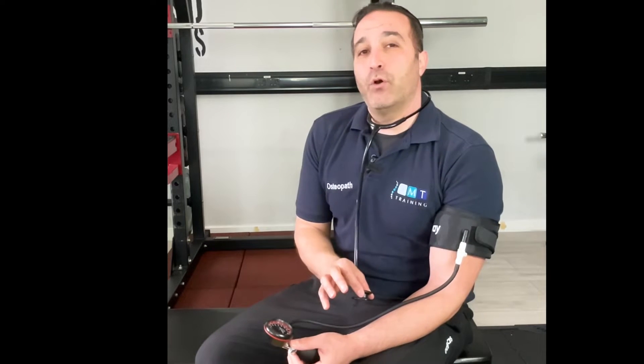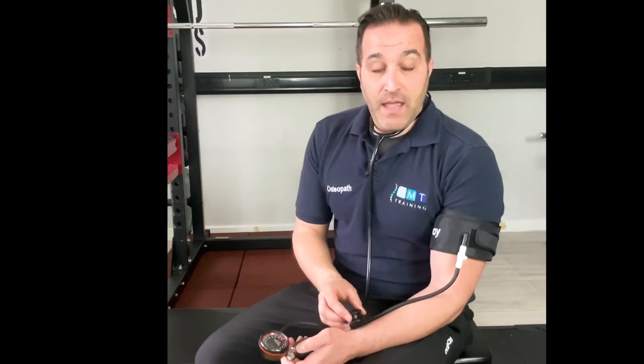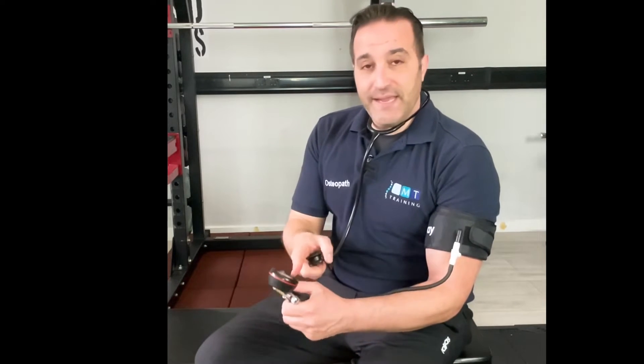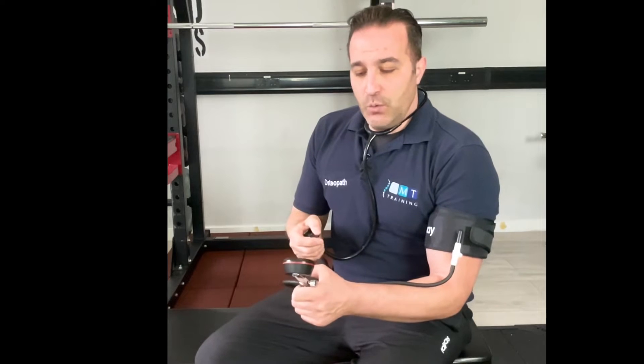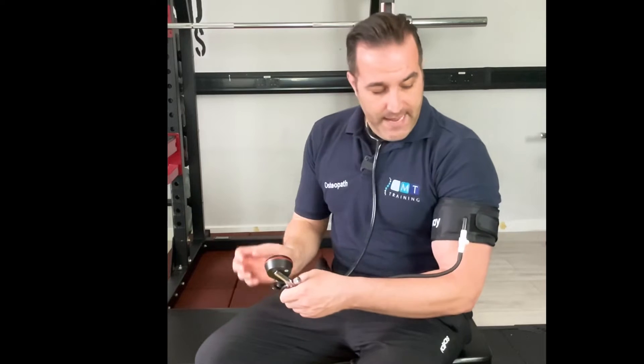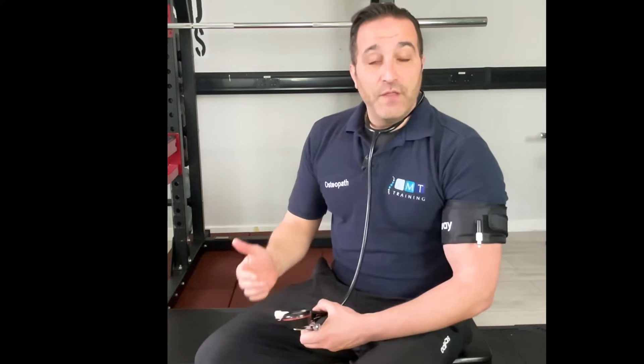If you're looking for around 50 percent of that pressure from 150, that would be 75 millimetres of mercury. Then what you would do is close the valve, and looking at the gauge, increase the pressure to 75. From here, you will then detach and perform the exercise that you wish to achieve.